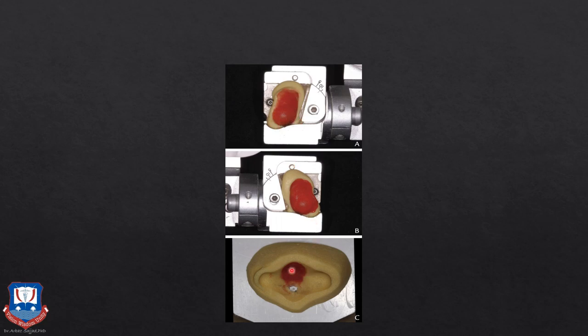And in a similar way, we also place acrylic on the incisal table and we get a customized incisal table. So this is the incisal guidance, this is the horizontal condylar guidance, and also depending on this we adjust the lateral condylar guidance.